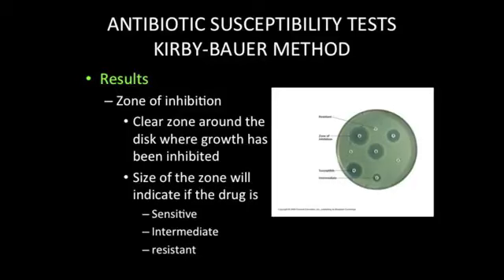So we can see here that the goal of the susceptibility test is to detect possible resistance to an antibiotic. The disk diffusion susceptibility test is an important tool that aids medical professionals in the selection of an antimicrobial agent that effectively treats a patient's infection. Other tests would follow the susceptibility test to determine appropriate therapeutic doses. We will discuss some of these in Unit 4 of the lecture component.